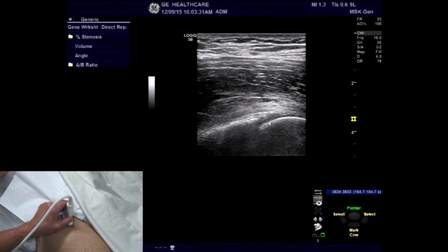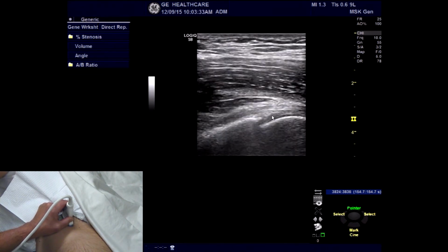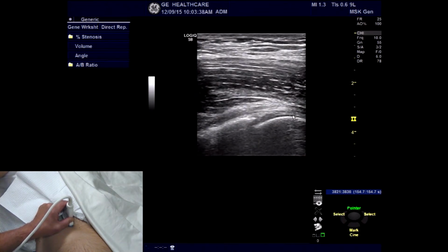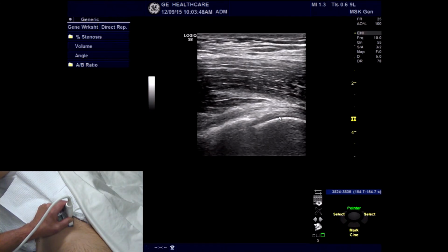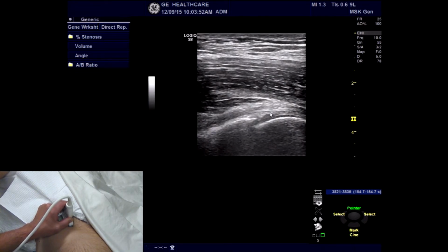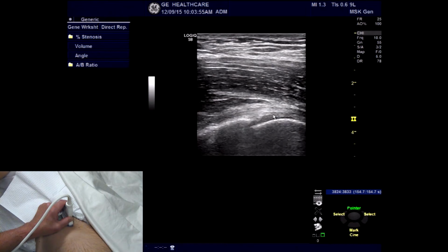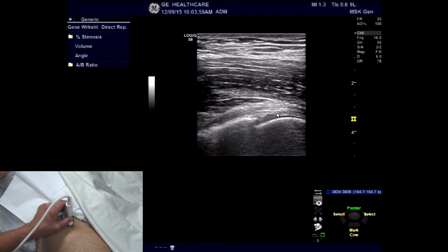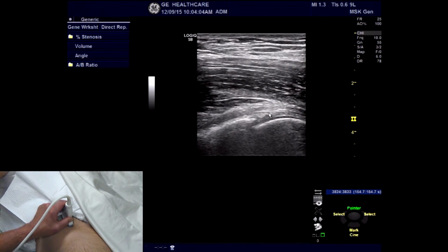area of the femoral head and keeping the acetabulum in view, we're going to see the hypoechoic structure that's in contact with the femoral head, and this is the articular cartilage that lies just superficial and in direct contact and adhered to the femoral head. Then you're going to see a hyperechoic, wedge-shaped structure that sits just superficial to the area of the articular cartilage, and that is going to be the area of the labrum of the hip.